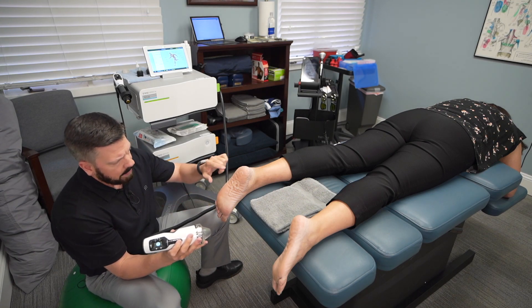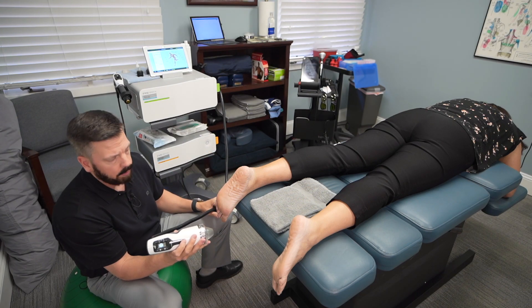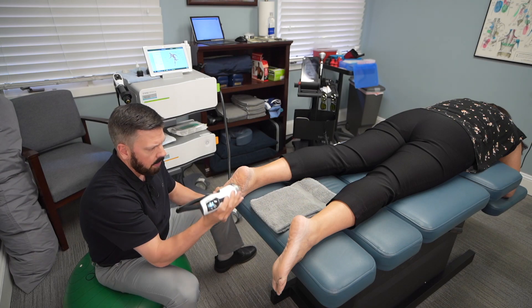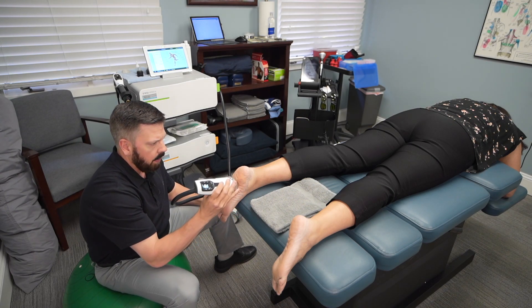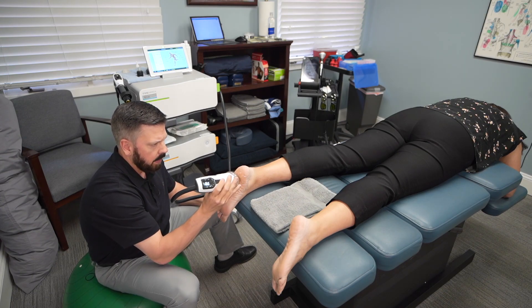So I want to demonstrate the treatment — we're gonna go up and down the calcaneus and then I'll ask Renee what she feels during the treatment. We're applying the focus shockwave all the way around here, and the ultrasound gel helps the shockwave conduct through the skin and get deep into the area.